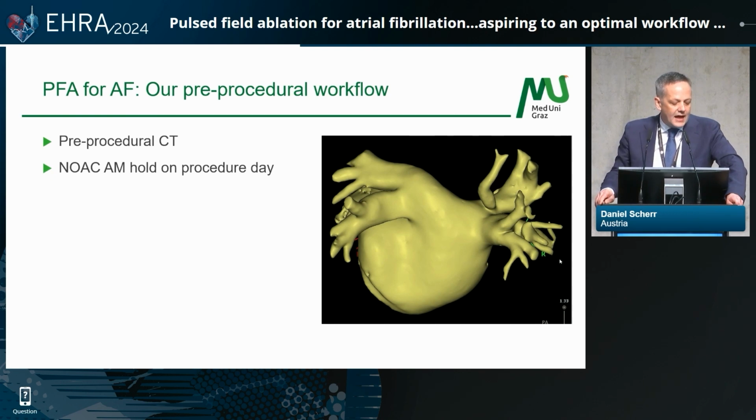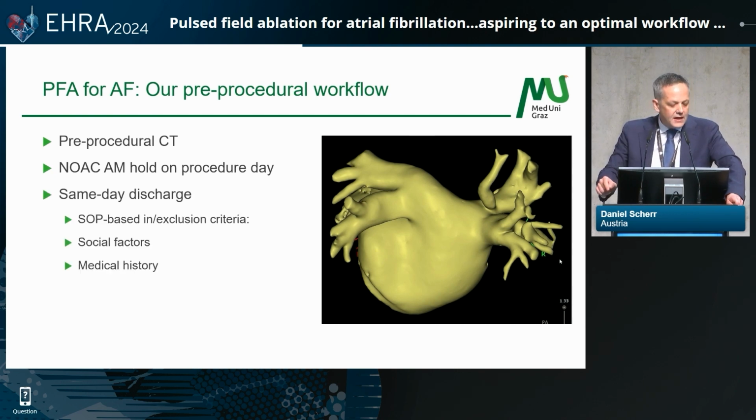We do a NOAC AM hold on the procedure day, and we heavily believe in same-day discharge. We have inclusion and exclusion criteria for the patients that are eligible for same-day discharge. Just to name two, as a social factor, when the patient is discharged the same day, it should not be a single-person household, for example. But we have a number of other factors that we tap into before we decide whether or not the patient is eligible for same-day discharge.